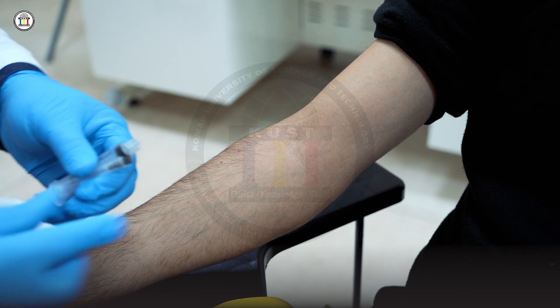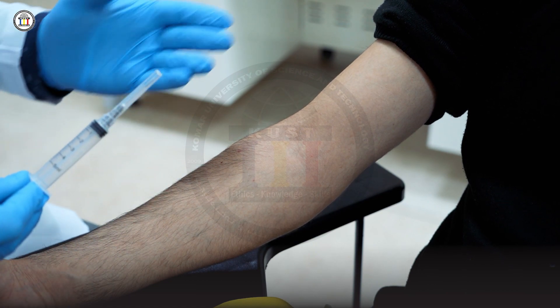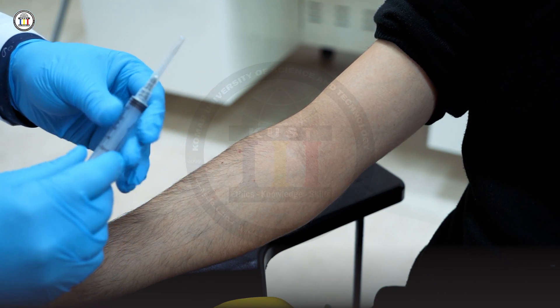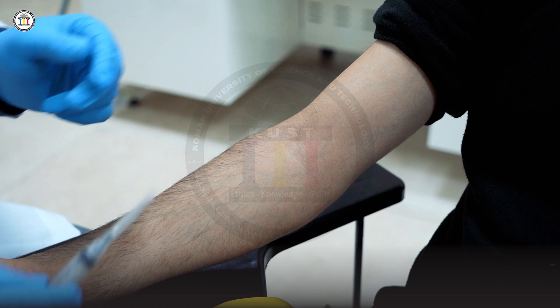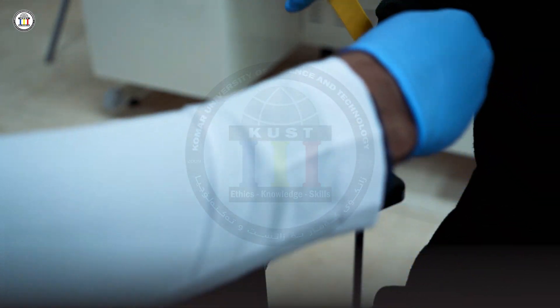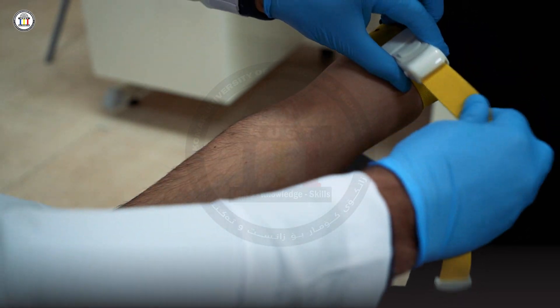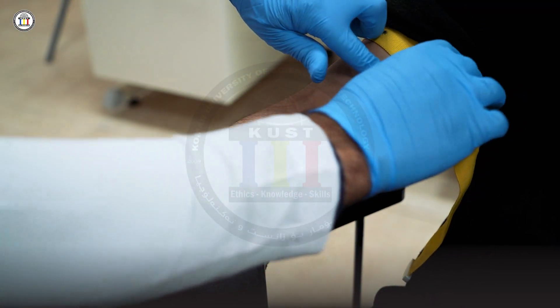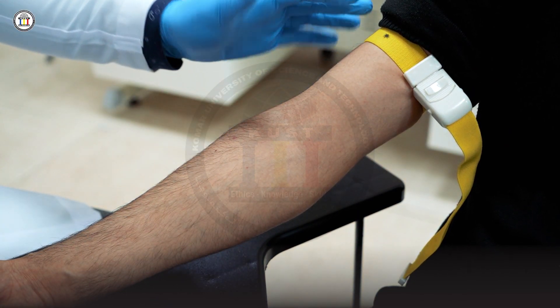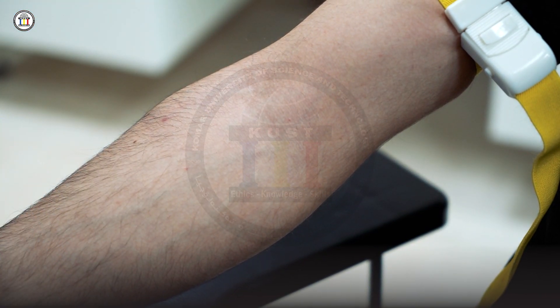During air drying, inspect your needle for any manufacturing defect. It's better to do this not in front of the patient's eyes. After preparing your needle, reapply the tourniquet to the same location. If you have experience you can apply it just once, but be careful — the application of the tourniquet should be fewer than one minute.